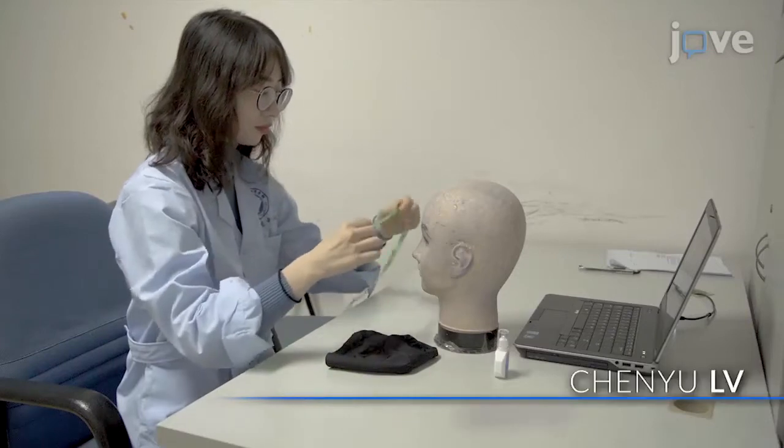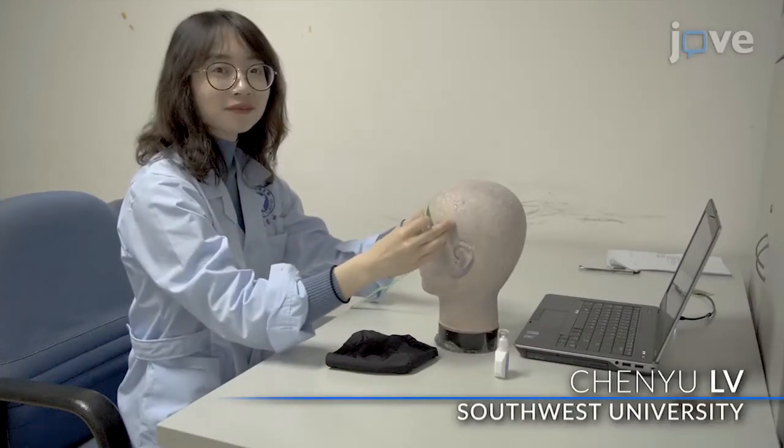Demonstrating the procedure will be Chen Yu-lu, a graduate student.